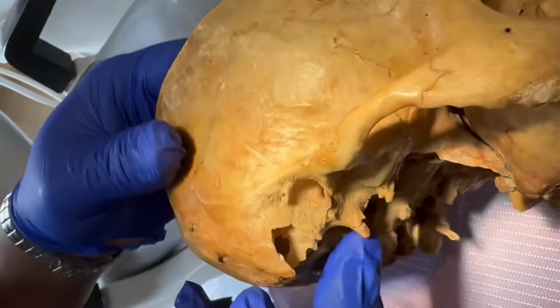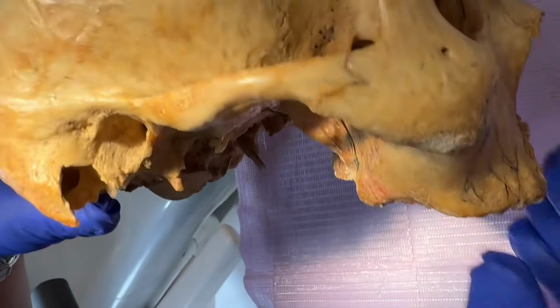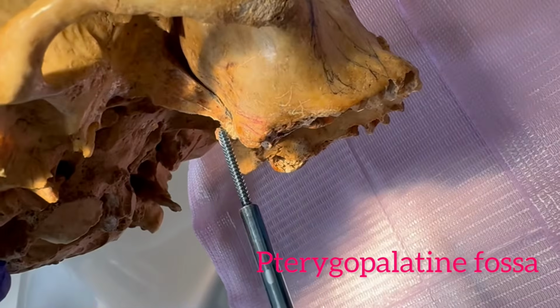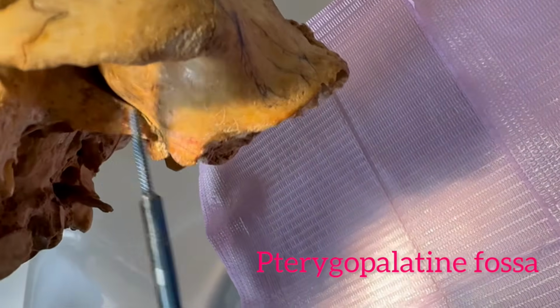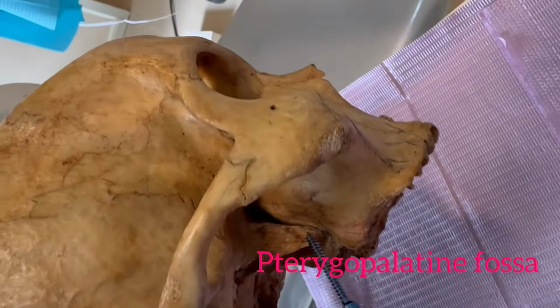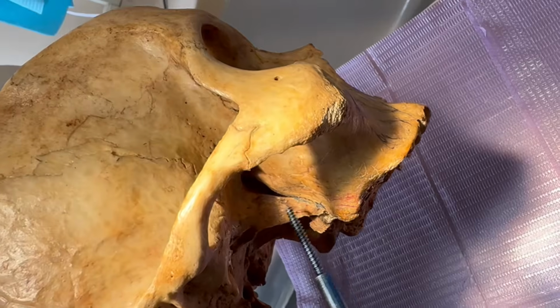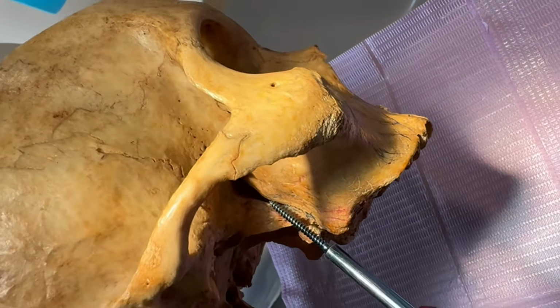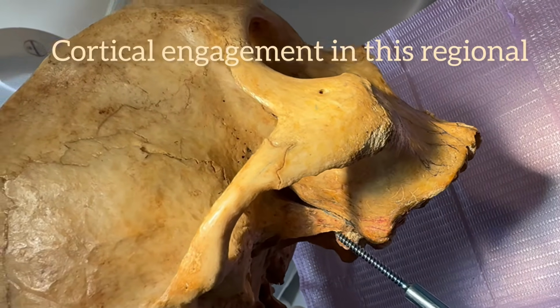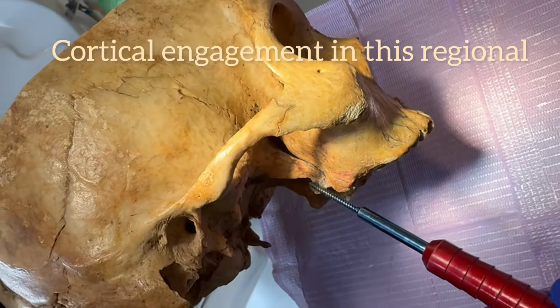Coming to the main important part where we engage our pterygoid implants, that is the pterygopalatine fossa. So this is the area, pterygopalatine fossa. Have a look. This is the fissure, pterygomaxillary fissure, which gives rise to the pterygopalatine fossa. Fossa is the space area where we get the bone to engage our pterygoid implant. You get D1 or D2 kind of bone, cortical bone, with maximum stability and anchorage you will get.